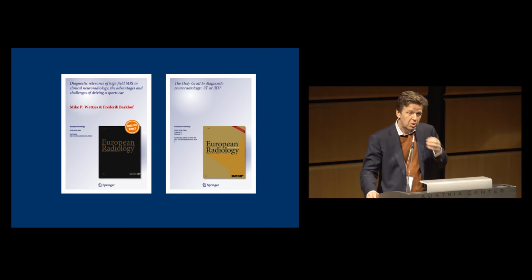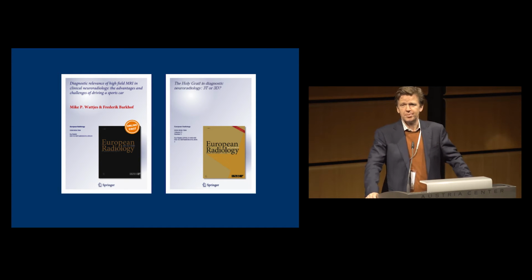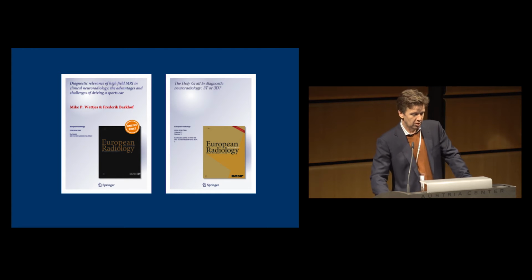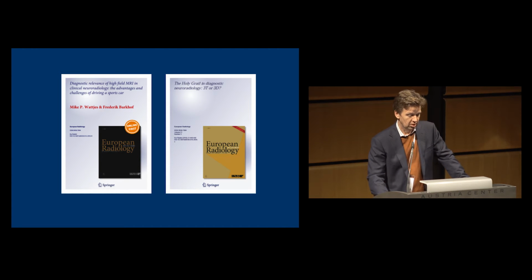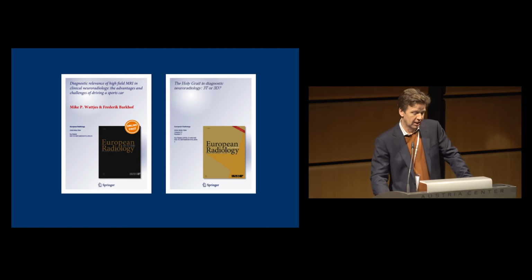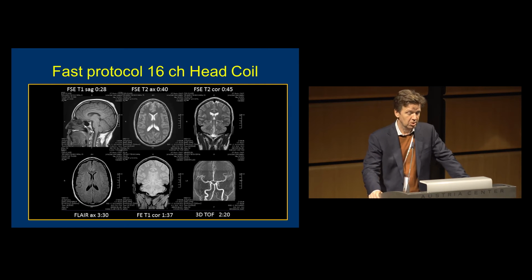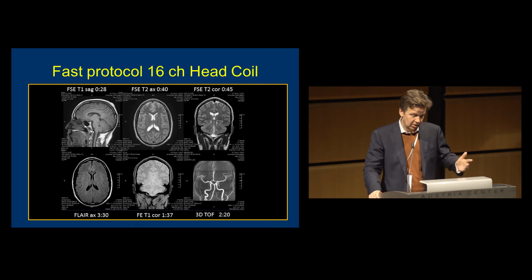So the big question, of course, if you have a 3T, is what to do with it. And people have looked at the diagnostic relevance of 3T and done a meta-analysis and said, well, it's actually quite difficult to prove the advantages. And we slightly jokingly wrote a commentary on that because, you know, the advantage or disadvantage of driving a sports car, you know, if you would have the money and the roads are good, why would you not drive a sports car if it's not that expensive? But the question is, of course, what to do with the 3T. So you can drive very fast, but you can also save time.